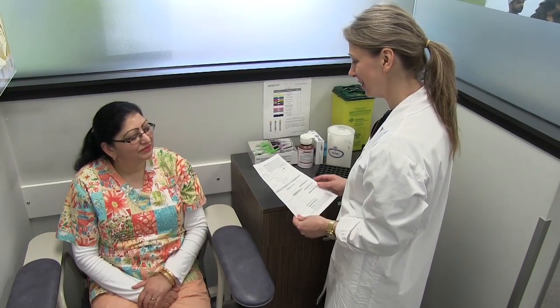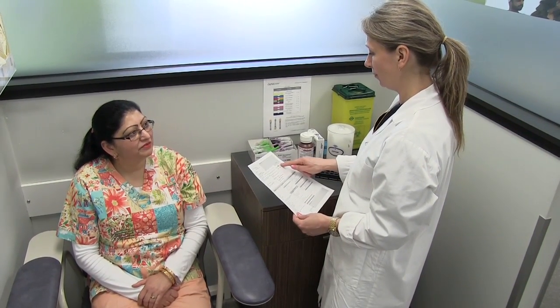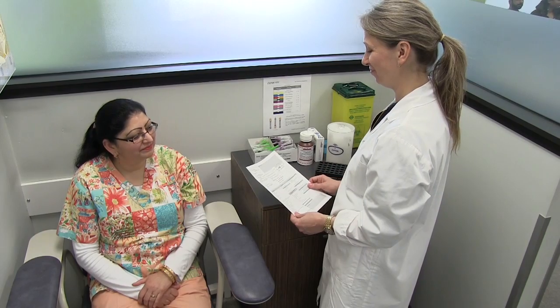To confirm your patient's identity, ask for two unique identifiers: their first and last name and their date of birth.